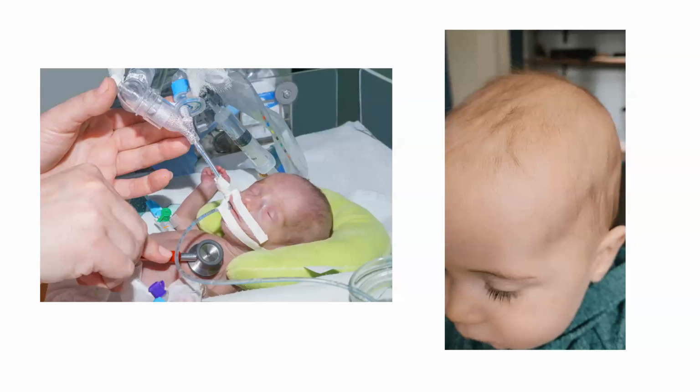Okay, let's annotate a little bit. You will all thoroughly enjoy my art. It's terrible, but please humor me. Sorry, I don't want to use the rubber, I want to use the annotate. So if this is the fontanelle and it's this small, and you have a curvilinear probe, it might be a challenge.